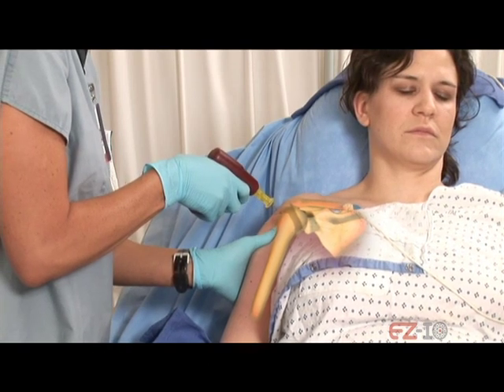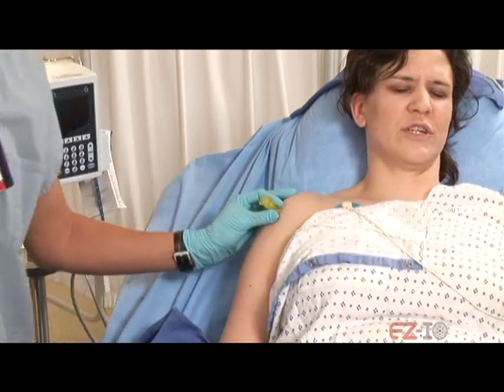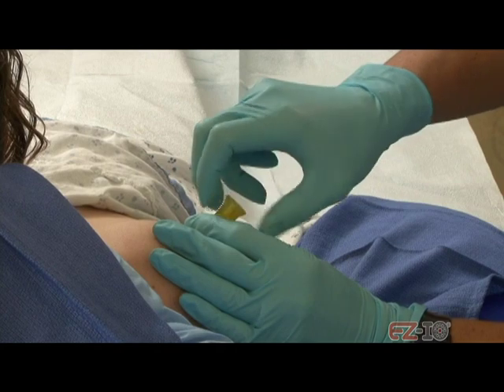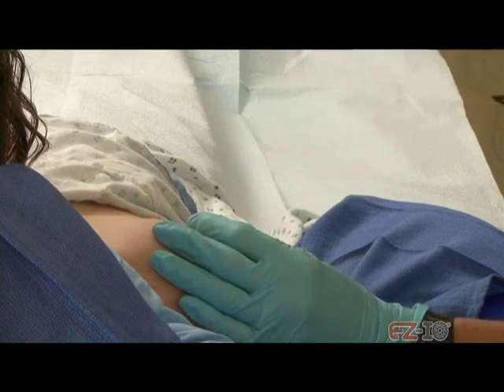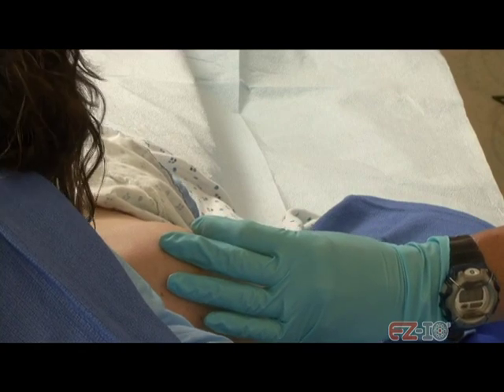Power the driver and advance, applying limited pressure until you feel a change in resistance. Stabilize the needle set hub and remove the power driver. Remove the stylet and dispose of it in an approved Sharps container.